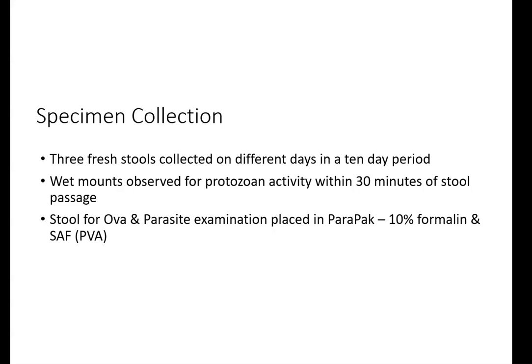On the side of the container, it has a line that says it has to be filled up to here, or don't go above here. I will show you guys those when we get into class again. But these stools are collected and then they come to us in preservative, and if we can have a fresh stool, so we actually get one in a container that didn't come in a para pack, and it comes to us fresh from, say, an inpatient, and we get it within 30 minutes of collection, we can actually make a wet mount to see if we can see anything moving in it. So then we would know that the critters are there and they're live and they're moving, and now we just have to process them to identify them.